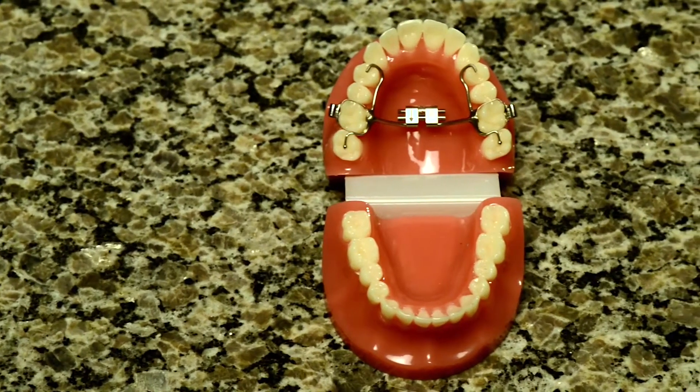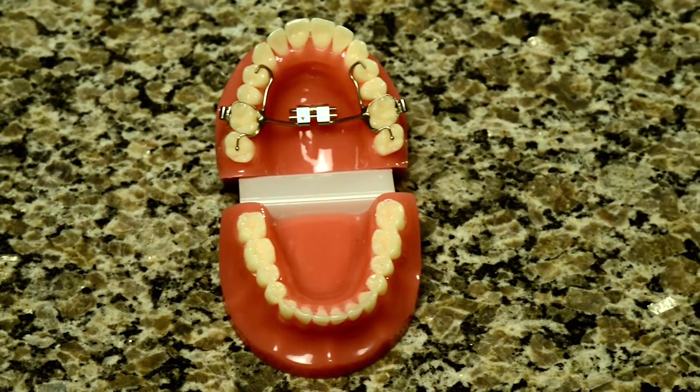RPE stands for Rapid Palatal Expander. Rapid because we're asking you to do one turn per day. Palatal because the two bones being expanded are the palatal bones, which form the roof of the mouth and the floor of the nose. Expander because you will be expanding one quarter of a millimeter per day, so it will take four days to open one millimeter.